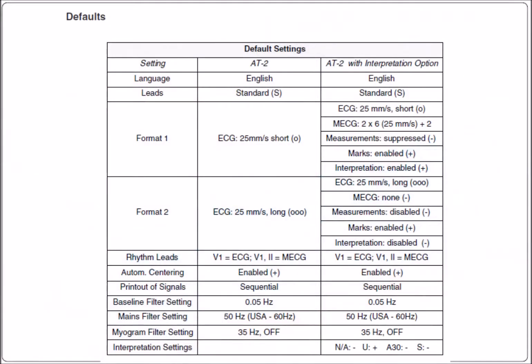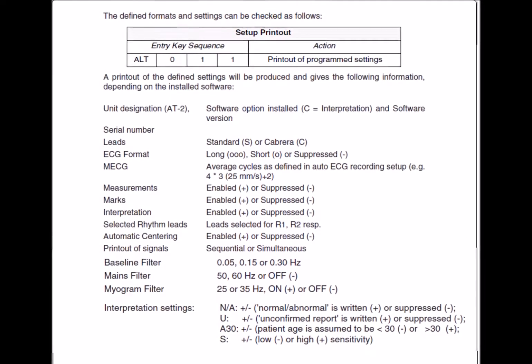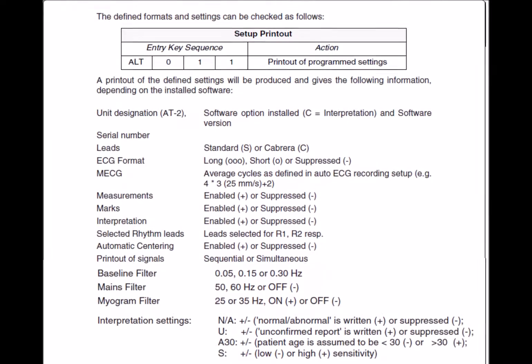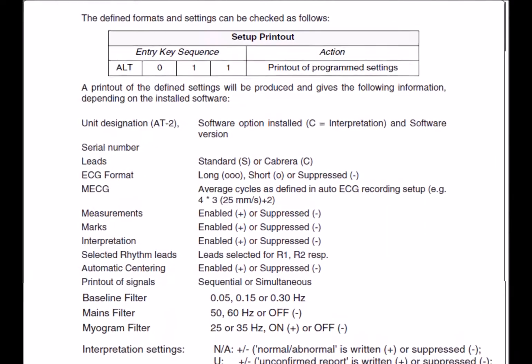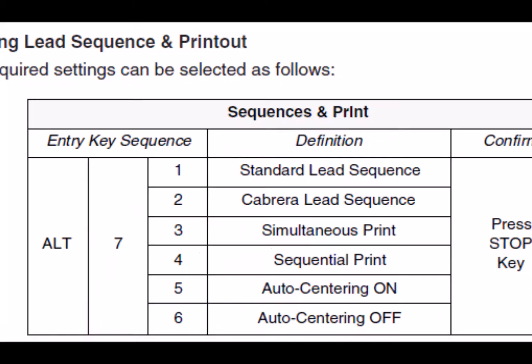The default settings are as follows. In order to obtain a printout of the current configured parameters, press the following keys. To define the lead sequence, press the following codes and confirm with the stop key.